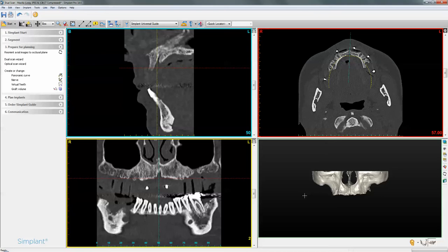The second scan consists of the denture on its own in the CBCT scanner. The position is quite important — it needs to represent how it was positioned in the patient's mouth. If it's a maxilla case with the teeth facing downwards, you would rest the denture on its teeth with the fitting surfaces above. If it's a mandible case with the teeth facing upwards, you would rest the denture on its flanges.